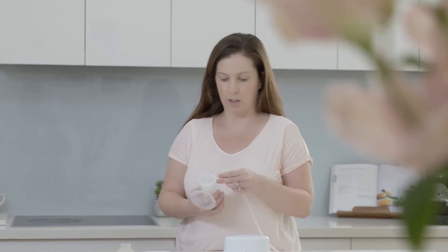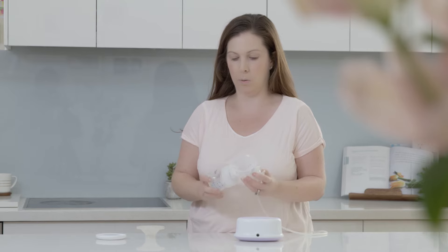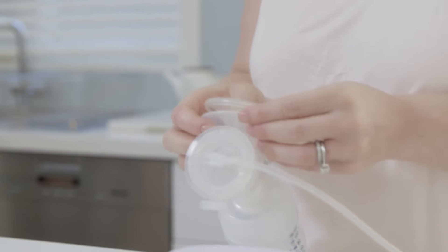This is the little electric unit — there are three speeds to use, which is really helpful. It attaches here and you can put the bottle straight on, which was great because it means you're not transferring it between a bottle and another unit. And this is the cushion piece that fits in — it was really comfortable.